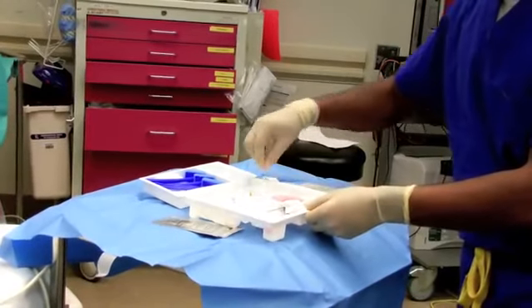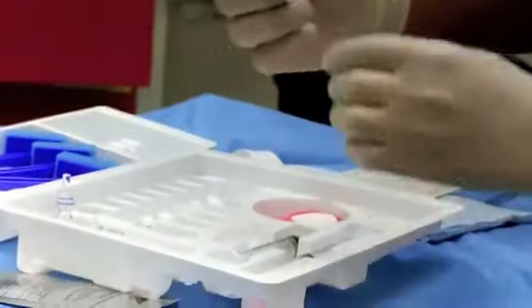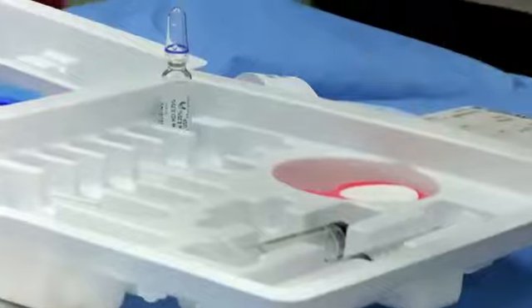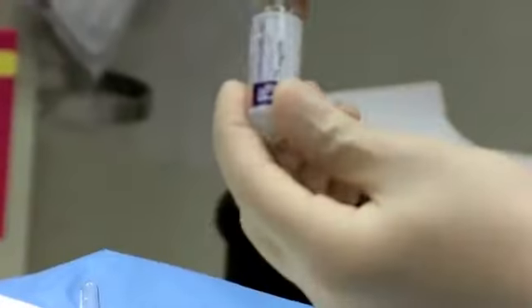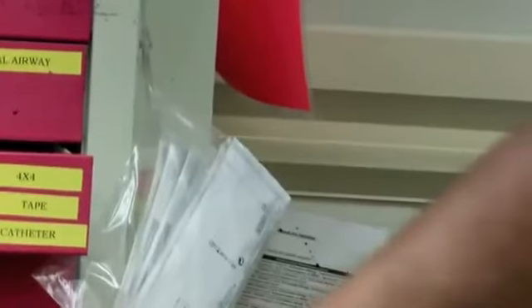In the kit, I have epinephrine that I'm not going to be using, spinal bupivacaine at 0.75% in dextrose, which I will be using, 1% lidocaine for the local wheel, which I will be using, my introducer needle, my needle for local infiltration, my filter needle, my spinal needle, right here.